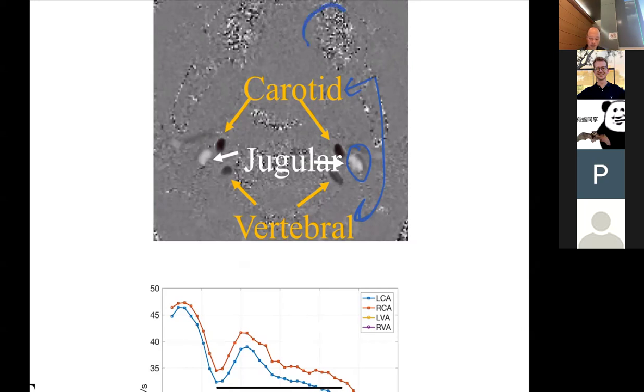And you see a lot of noise here, right? And that's just because there is noise and things aren't perfectly ideal. It's never perfect, and phase is very noise sensitive. But the idea is you're getting a good measurement of the velocity within the vessels.